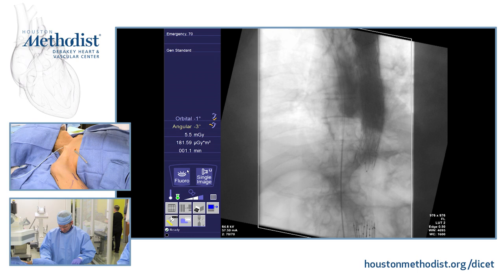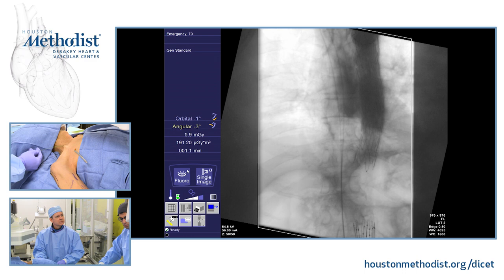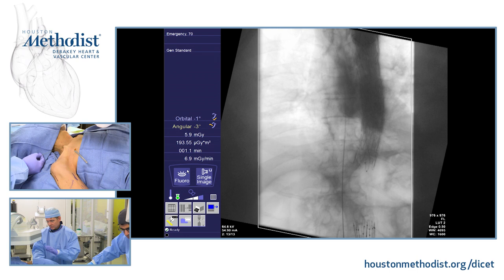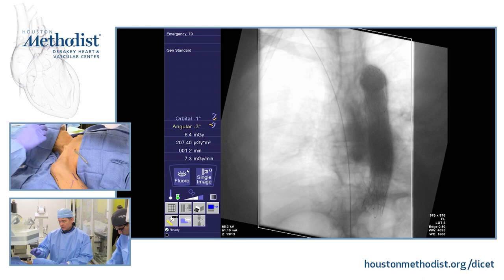We'll pass that down with fluoroscopic guidance until we can see the wire down in the inferior vena cava. At this point then we have a stiff wire going down the inferior vena cava through the occlusions.